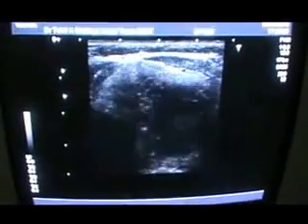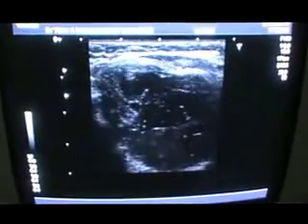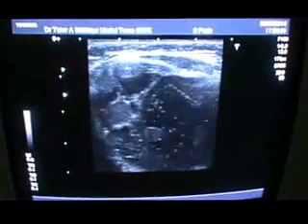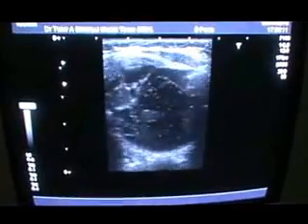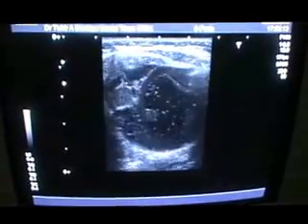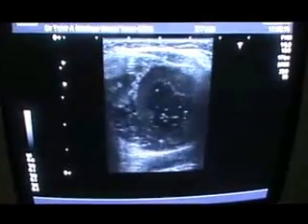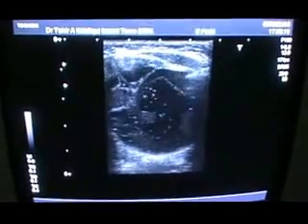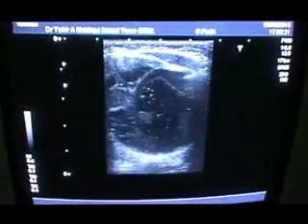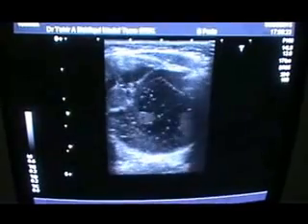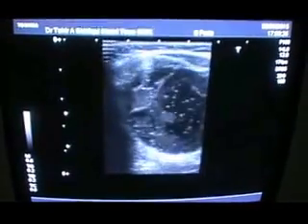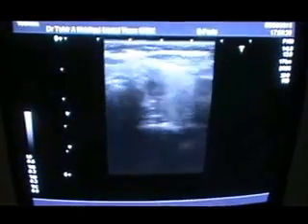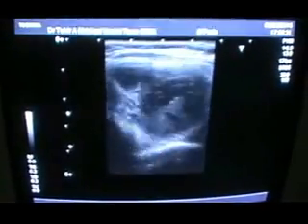As I move the probe posteriorly, we will see a cystic mass that is full of internal echoes and is bounded by a thick rim of tissue around it. This is relating to the posterior inferior surface of the left thyroid gland.